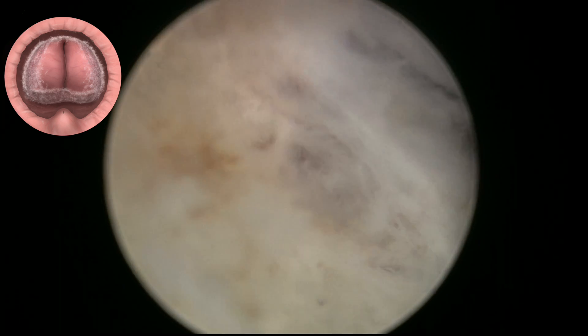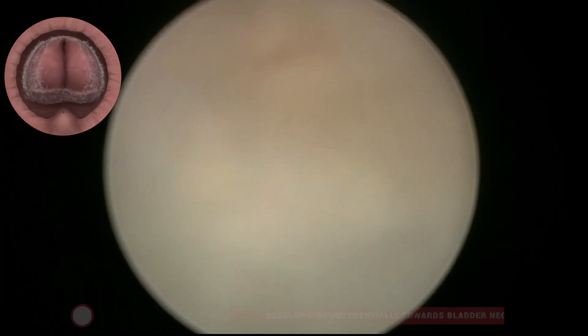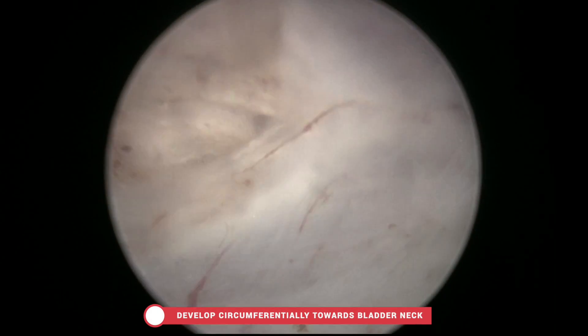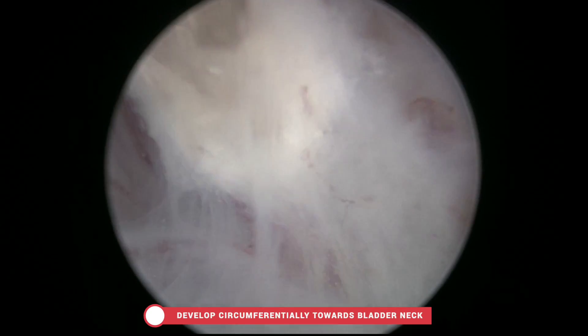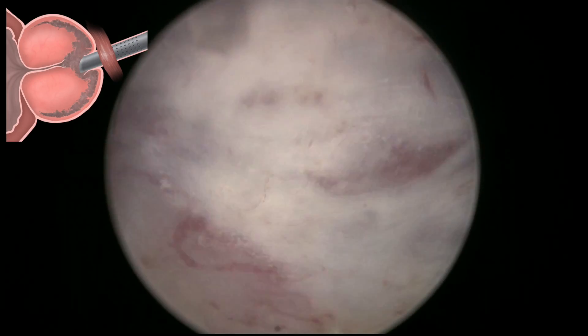This would be the end of the early apical release. It's not an immediate apical release — it's an early apical release, and it requires these steps of careful mobilization of the apex until the sphincter can be released.